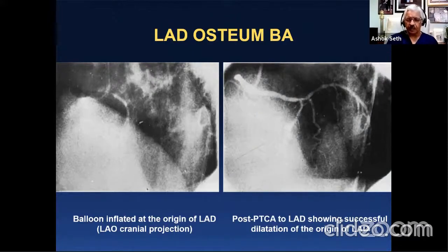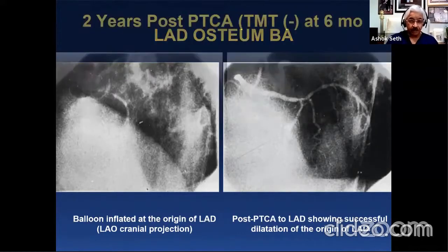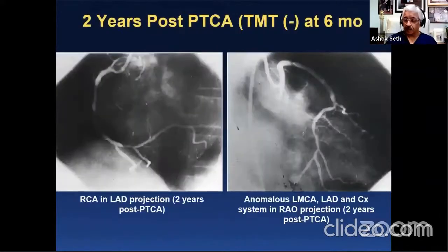I would shudder to do that angioplasty, a PCI, today, even with stents, but I did it in those days because there was nothing better to do, I guess, building up the PTCA program, as we called it. This guy did well. Six months later I did his exercise test, it was negative, and I sent this one for publication, and three journals refused it, saying, we do not recommend such heroism, which would create bad examples for interventional cardiologists.